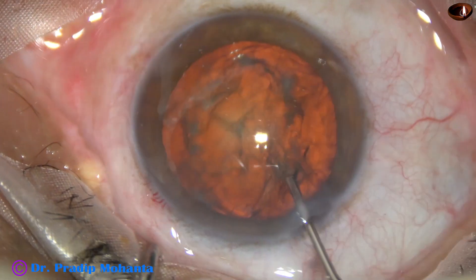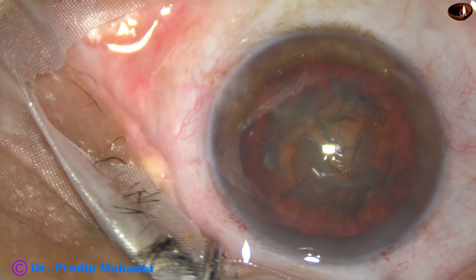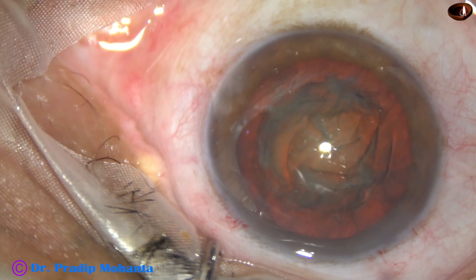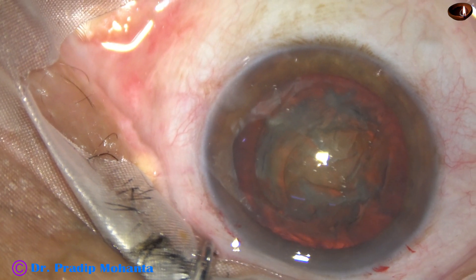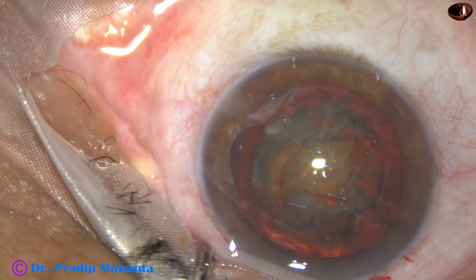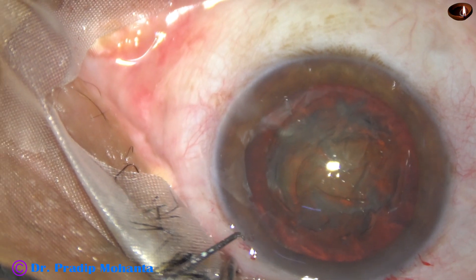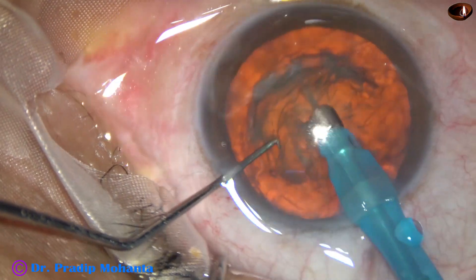Hydrodissection is done and the nucleus is rotated. Visco is again used to fill up the anterior chamber, and then the phaco needle goes in. In this case, the machine being used is Faros from Oertli, Switzerland. The phaco needle goes in with its bevel down.